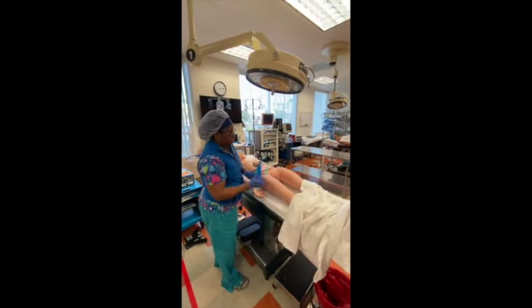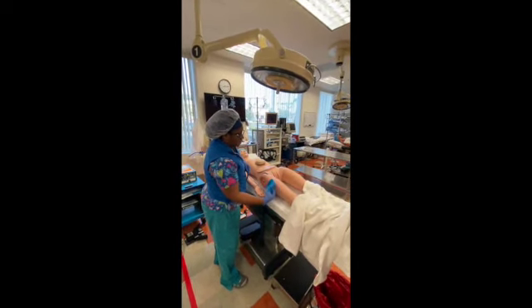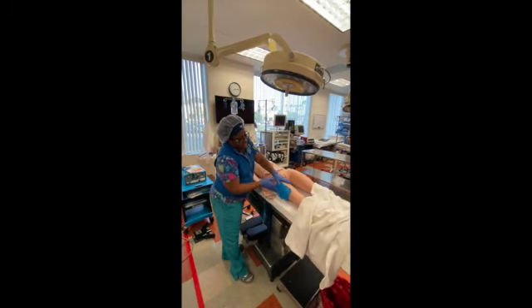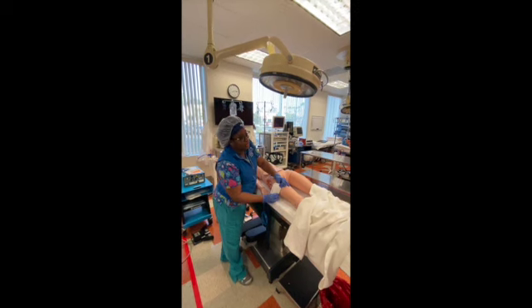If you're with Miss D or Miss Z, she likes hers to the top, so the bovie is placed right there. Let's go ahead and use that. Keep in mind I have it like this so that we can pull it back off at the end.